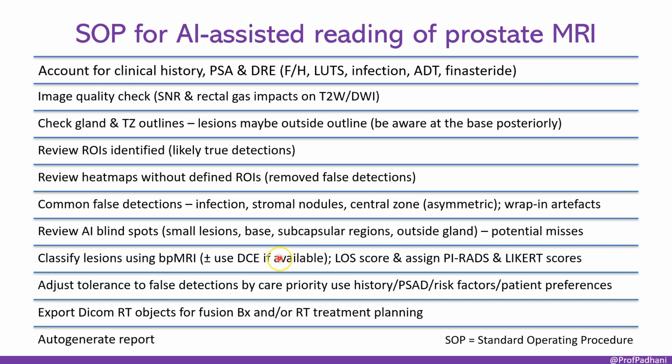potentially adjusting your tolerance for accepting AI findings based on clinical priority, patient factors or PSAD, ensuring correct export of DICOM RT objects if using for fusion biopsy or RT planning, and using the AI output to help auto-generate standardized reports. Remember, SOP stands for Standard Operating Procedure.